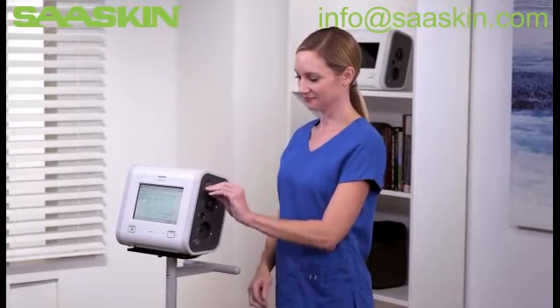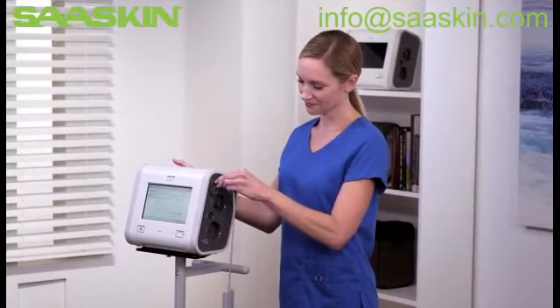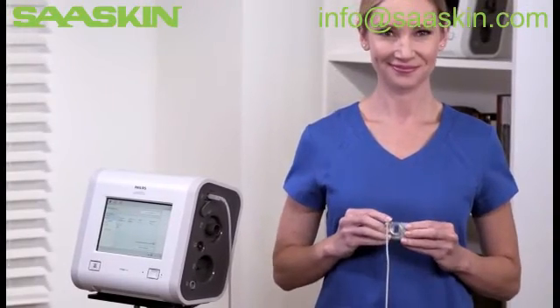To check Etco2 levels, insert the USB end of the cable into Trilogy EVO and attach the appropriate airway adapter on the other end. The adapters are available in adult, pediatric, and infant sizes.